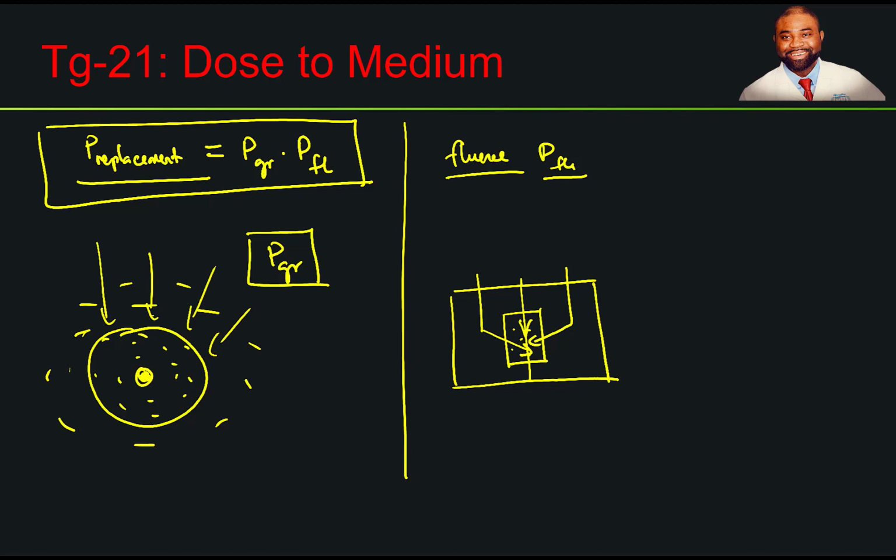On the other hand, the obliquity effect, electrons just go straight through the sensitive volume and really do not contribute to those. And so what you realize is that the in-scatter effect increases the fluence within the cavity because electrons are not scattered out by the gas, and the obliquity effect decreases the fluence in the cavity because the electrons go through instead of scattering.